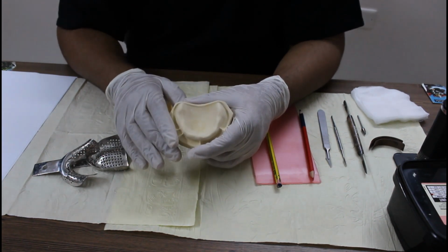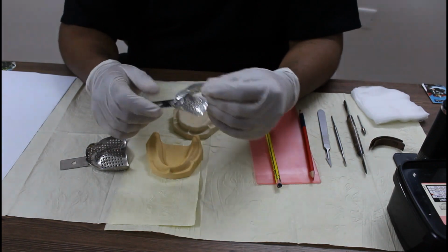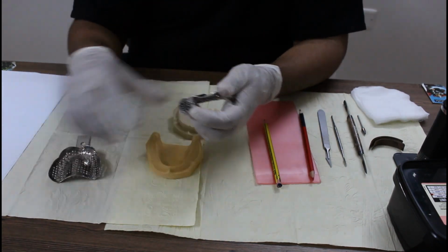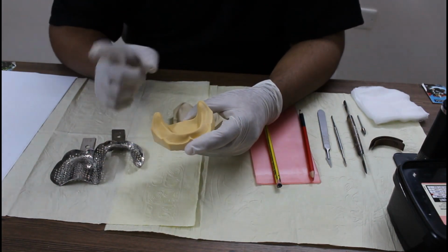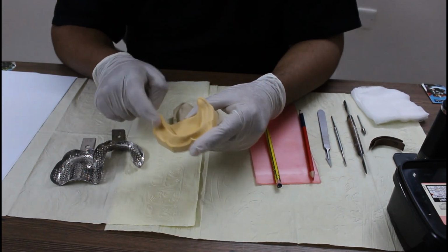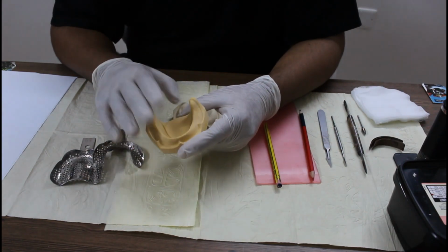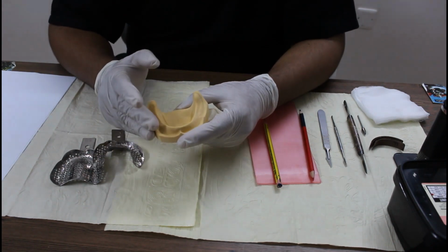don't want any pressure. So, you understood the procedure? Patient comes to you, you take stock trays, you make an impression of the patient's mouth with alginate, you pour the cast, you get the primary cast. Now on this primary cast, we make one more tray. That tray is according to this patient's mouth, so it is called a custom tray. It means we have customized the tray according to the patient's alveolar ridge: what is the size, the width, the length, the height.